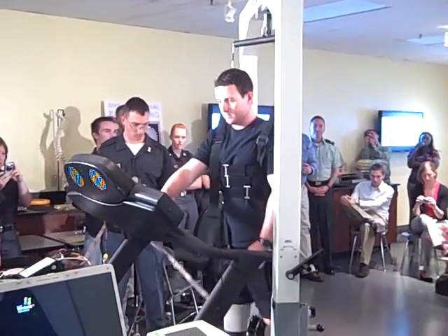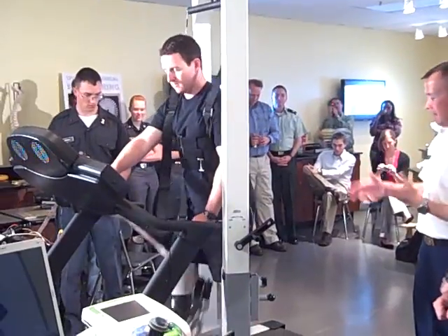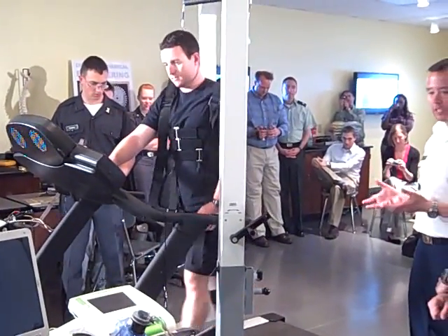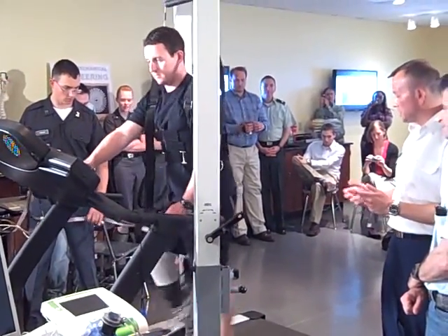It's the first time we've ever tried this, so we're excited about it. The code we have on board is running code — it's going to take time until it gets up to running speed before it works. So just kind of give us a chance here.